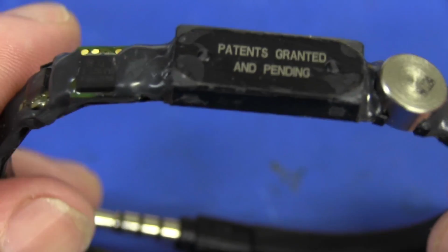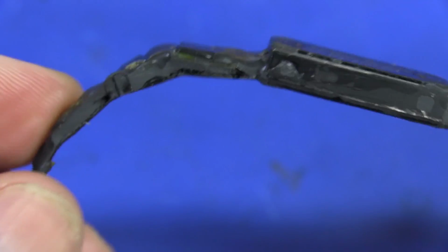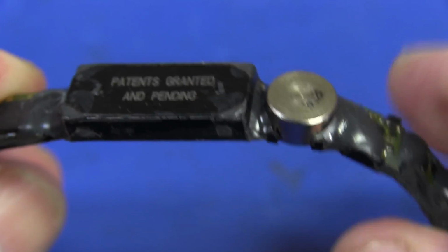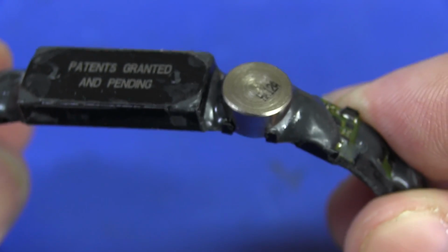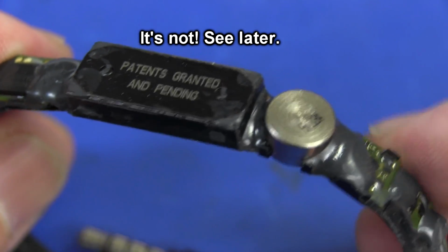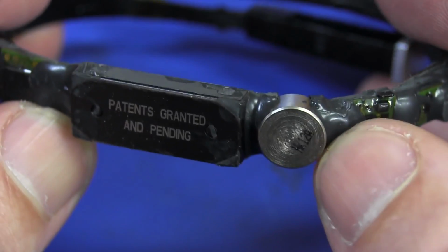So here it is, and it looks like it's actually assembled with like 0.5, I don't think it's 0.8 millimeter. It's probably 0.5 millimeter board, but it's not flexible. It's just gunked together like that. So when you flex it like that, there's a bit of give in there, but I think they've just used very thin regular fiberglass board in there, and this what looked like a magnet at first glance, I believe, is actually a piezo ceramic accelerometer, which I didn't really expect in this. I expected just a solid state MEMS type accelerometer or something like that. It certainly looks to be that same sort of round machined shape as you get with those high-end piezo ceramic accelerometers, if you're familiar with them.